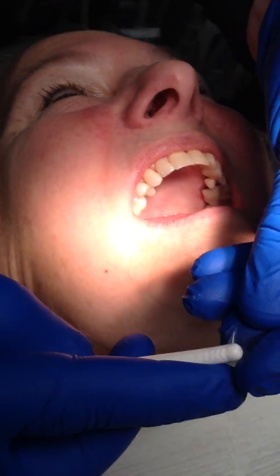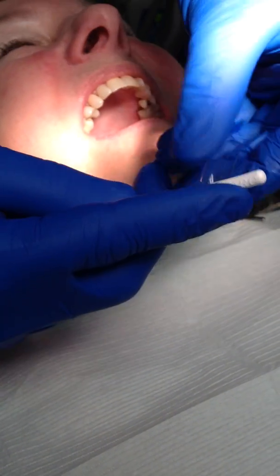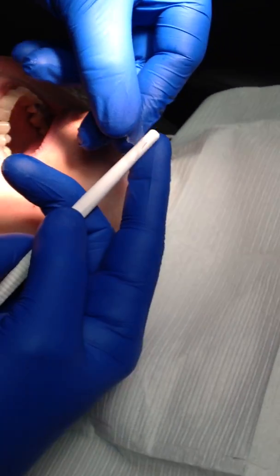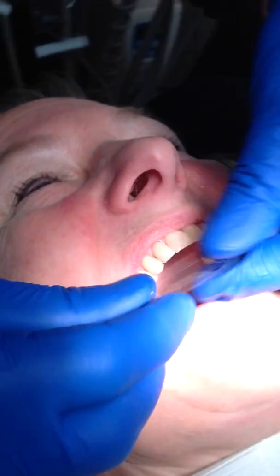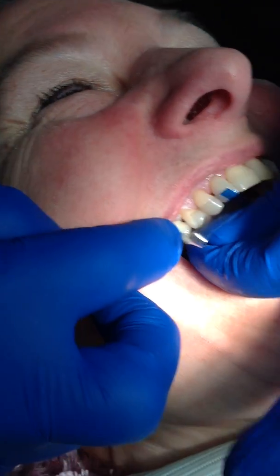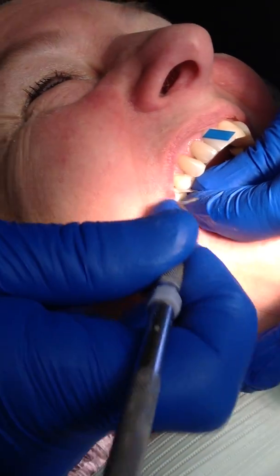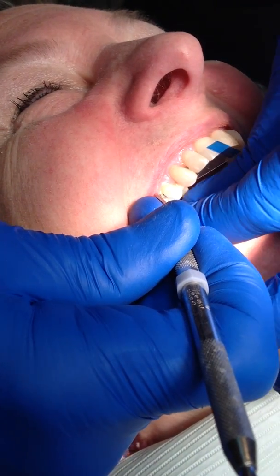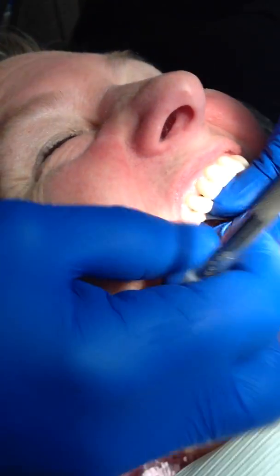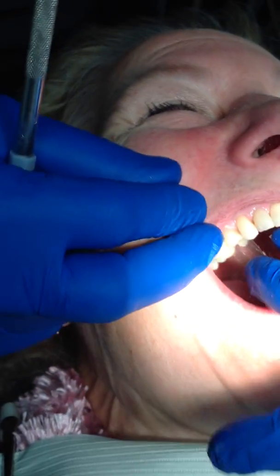Then we take a mirror handle or another round instrument, put it in and then pull up so that the bottom part of the band actually tips out like that. Then what we'll do is put this in between the teeth. And like what happens in most cases, the contact is too tight to get the band through. So we'll take a spoon and wedge the teeth apart so that we can put the band in. And then we'll pull it tight, pulling it down.